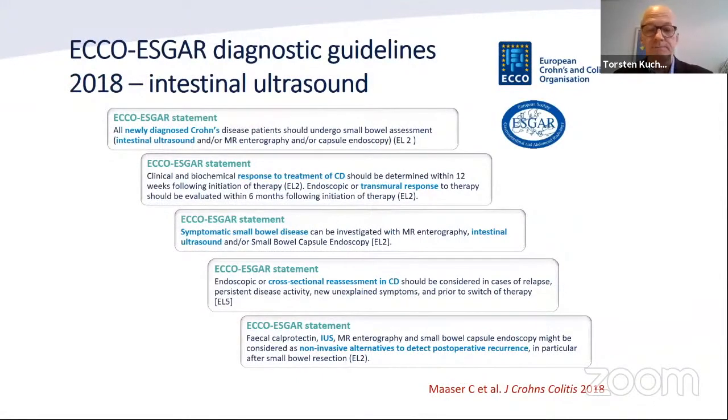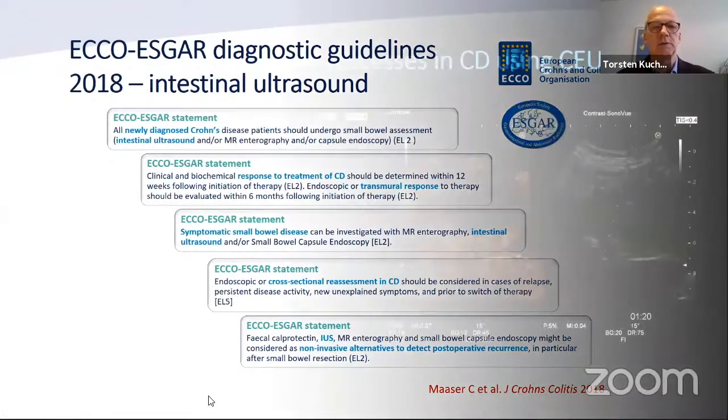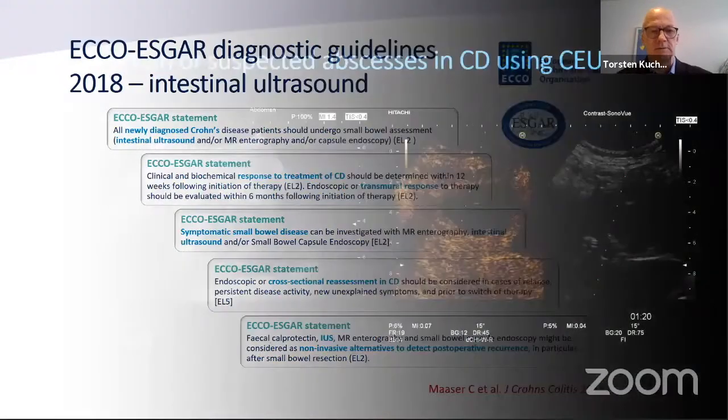And that's why intestinal ultrasound is now implemented into the ECCO-ESGAR guidelines. You've already seen this. Different statements include intestinal ultrasound. It's suggested in newly diagnosed Crohn's, or if you look at response to treatment, symptomatic small bowel disease, reassessment, if you want to predict disease outcome, or in the post-operative course. So in the different clinical indications, you can use intestinal ultrasound.